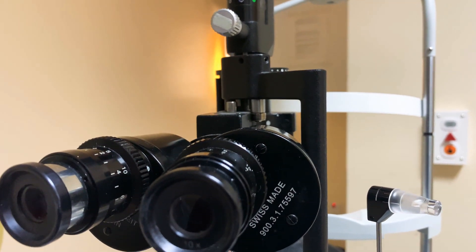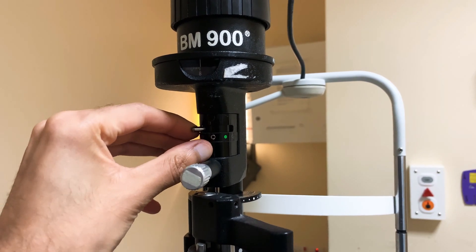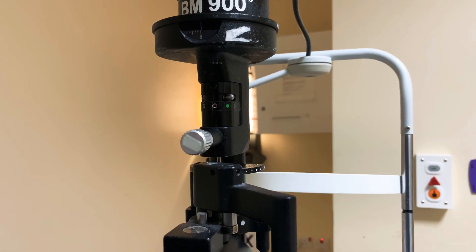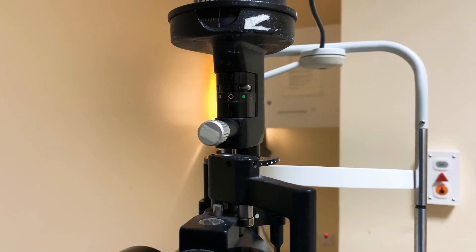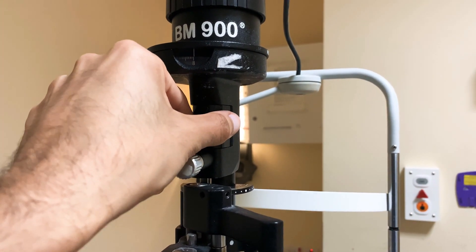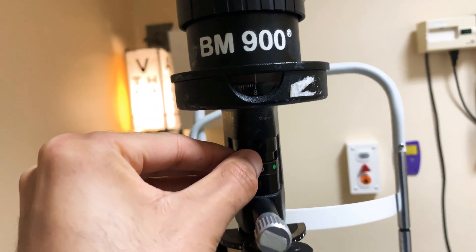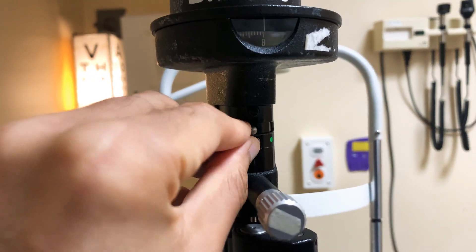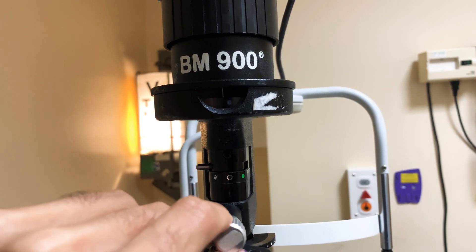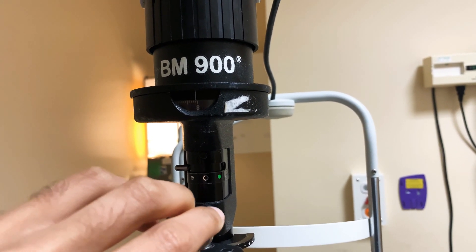Next, check the filter. Most of the time you'll use the white filter. The only other filter you'd want is the blue filter. Many people confuse the green and blue filters — someone might select green thinking it's blue, then report no fluorescein uptake when there might be a massive corneal ulcer. The blue filter is accessed by turning the beam height all the way to the end. You can change the height of the white filter but not the blue filter, and it goes up to eight millimetres.